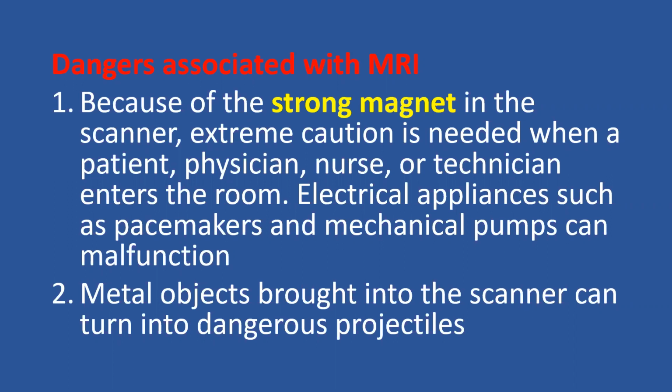Don't go into the room if you have particles in your eye. This can cause you to have blindness. Don't go into the room if you have some particle or shrapnel in your brain, because this can change position and you can die. This all arises because of the strong magnet in the scanner.